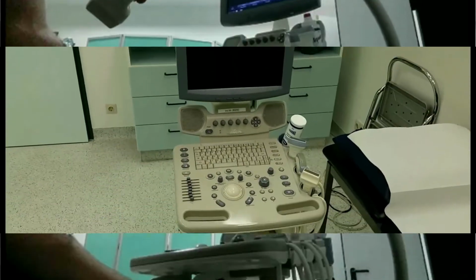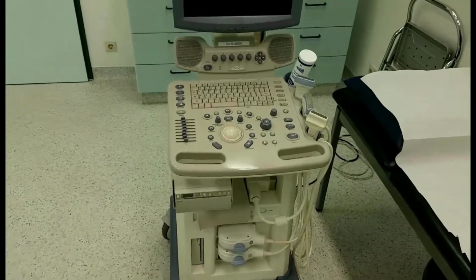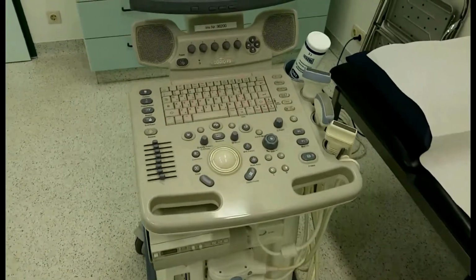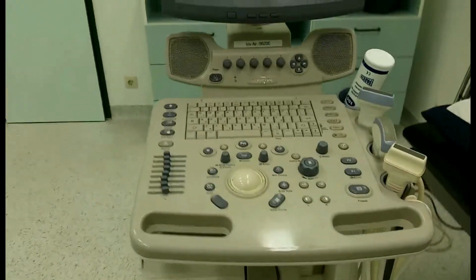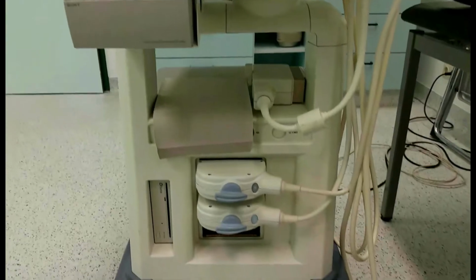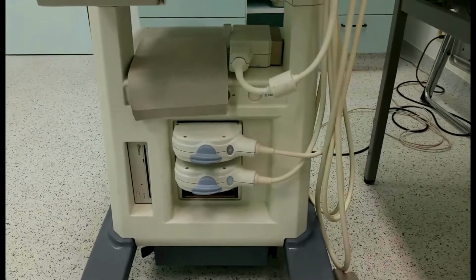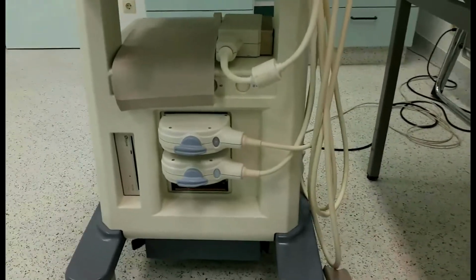So let's begin. Let me introduce you to this wonderful medical device. The technology was first used in the military for the detection of submarines and later used for the investigation of materials. Today its most common use is obviously in hospitals for clinical diagnostics.